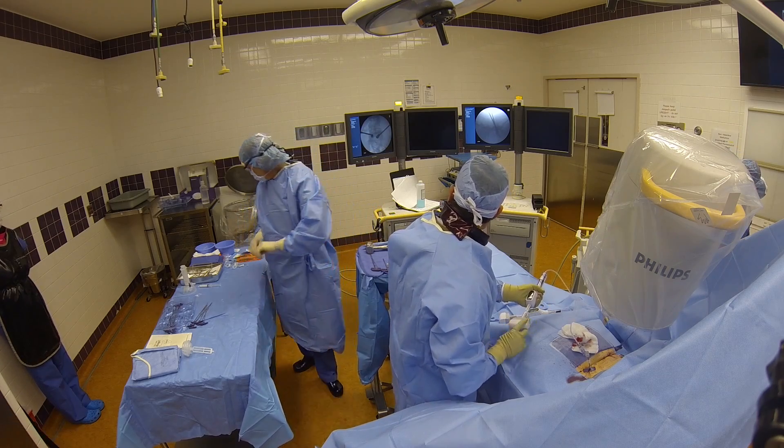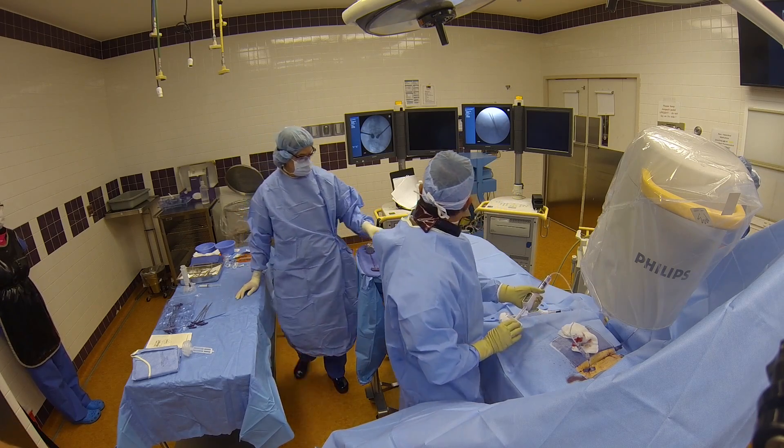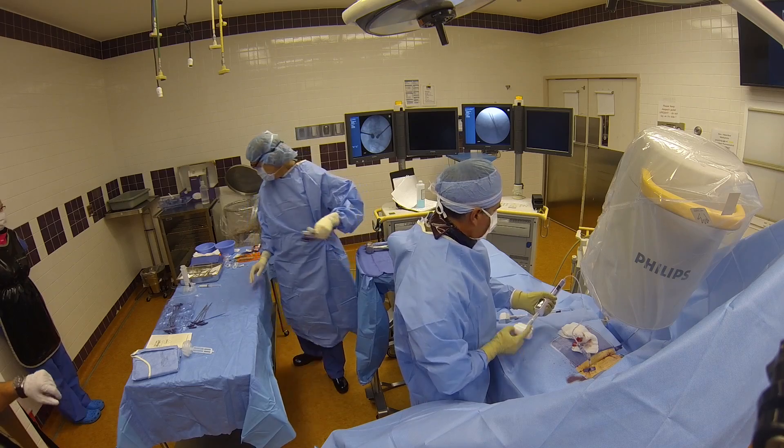Next, I place the balloons. They are filled with water and a special dye that makes the water visible on x-ray.